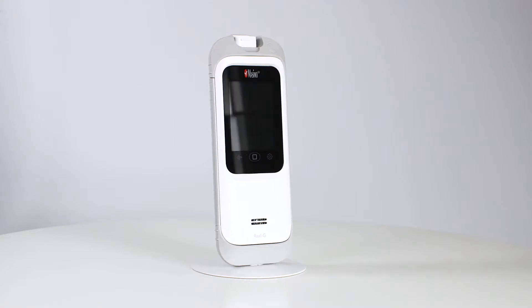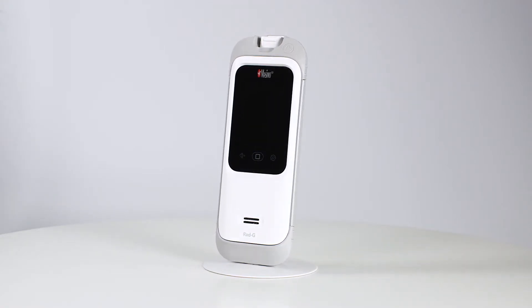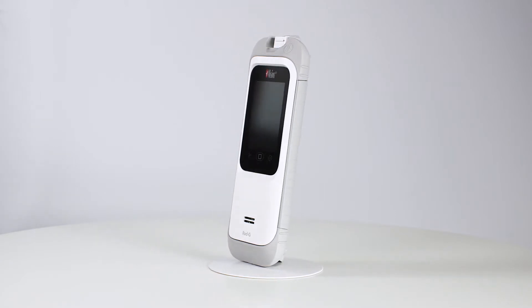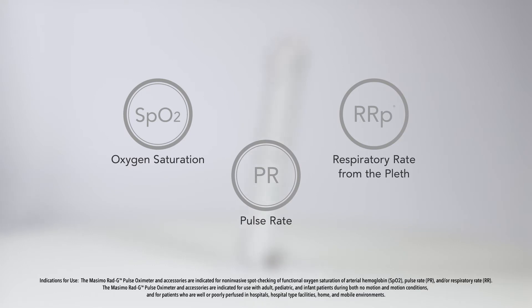The Massimo RadG is a handheld fingertip pulse oximeter that enables non-invasive spot checking of functional oxygen saturation of arterial haemoglobin, SpO2, pulse rate, PR, and respiratory rate, RR.